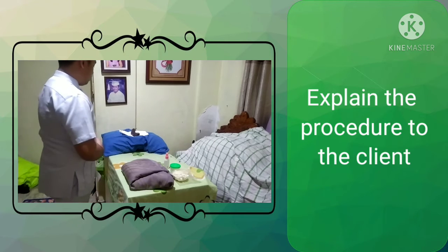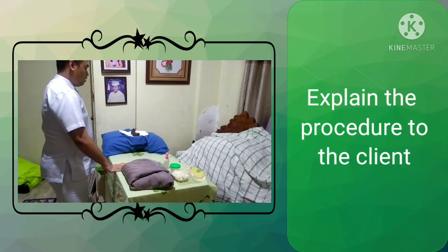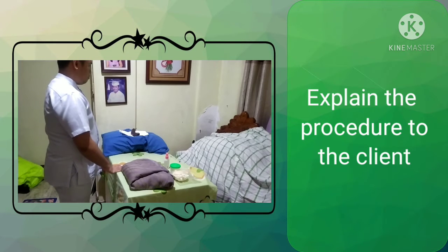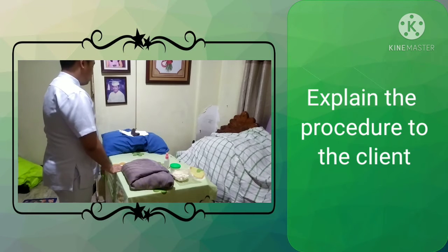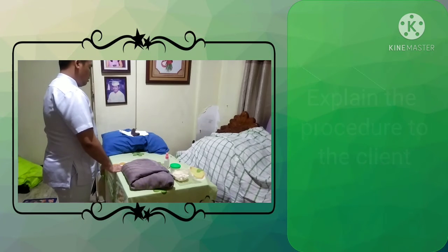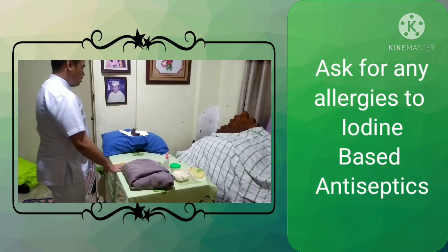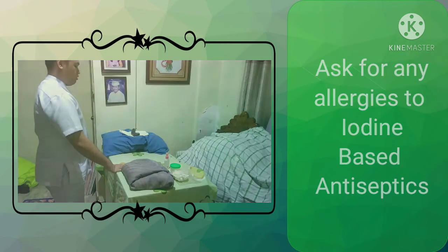Sir Talong. So Sir Talong, ang gagawin po natin ngayon ay maglalagay po tayo ng Foley catheter sa inyo. Para po malaman po natin o ma-measure po natin yung inyo pong urine output or yung ihi po ninyo, at the same time para po makatulong ito sa inyo pong mga pag-ihi. So, ayun po, meron po ba kayong mga karagdagang tanong sa ating gagawin po ngayon? Wala naman po. So, meron po ba mga allergy sa seafoods or sa mga isda or sa mga hipon, ganyan? Wala naman po. O, sige po.